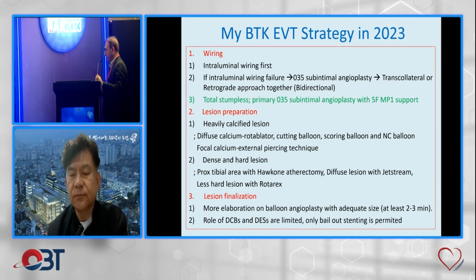Also avoiding unnecessarily long procedures using the subintimal approach is one of the key teaching points. In other words, you take a stiff wire and try to guide it slowly centimeter by centimeter through a long occlusion. It may take 4 hours and it may not succeed, as opposed to taking a subintimal approach and getting the procedure done. That is probably one of the best messages.